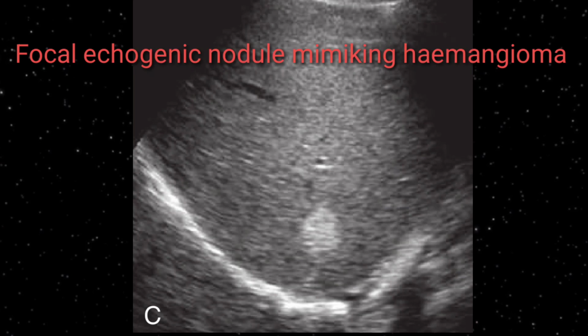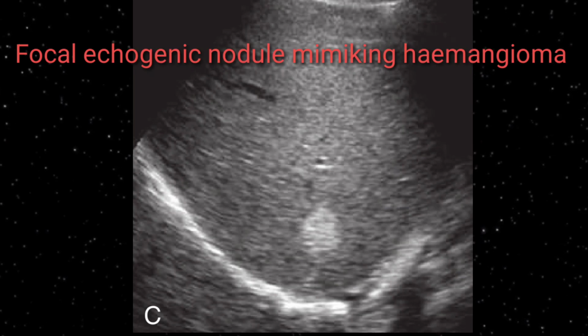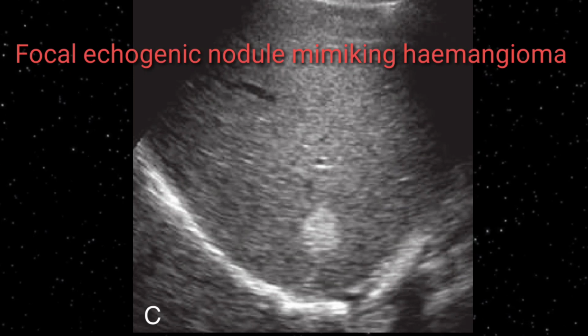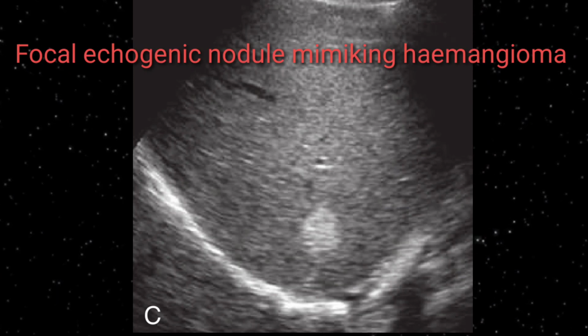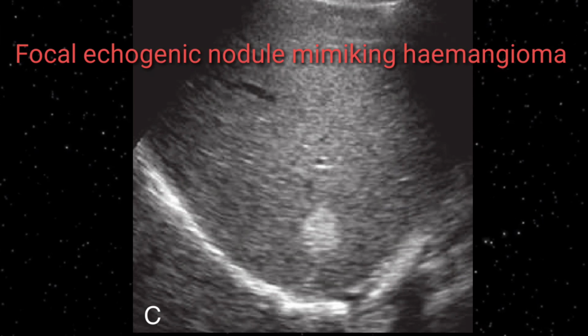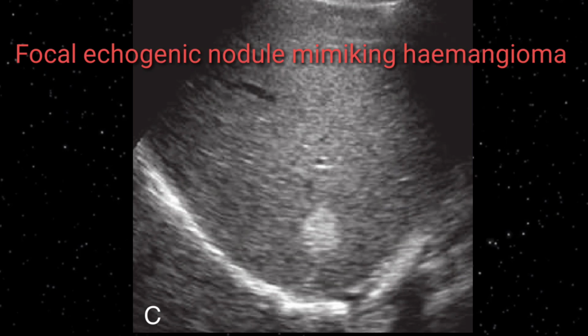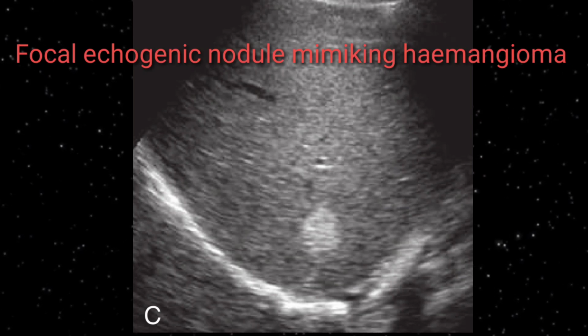This slide shows a cirrhotic liver as well. Although margins are smooth and regular, there is no irregularity of the margins. It means that it's not a well-developed case. You can consider it an early stage. A well-defined echogenic nodular focal mass can be seen in the right lobe. This is an echogenic nodule. Usually HCC presents in this form as well.